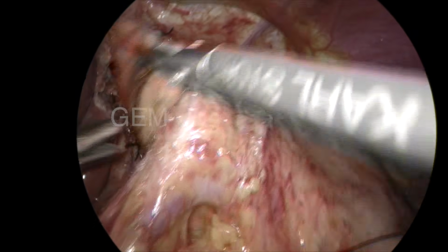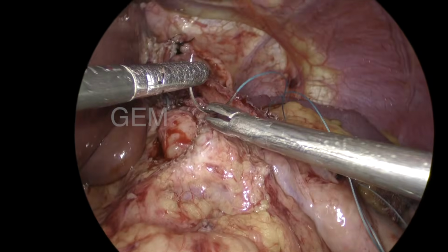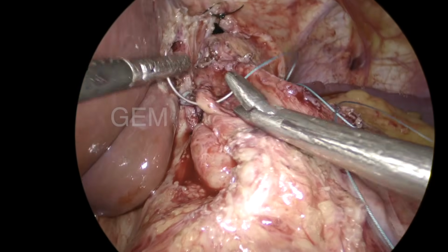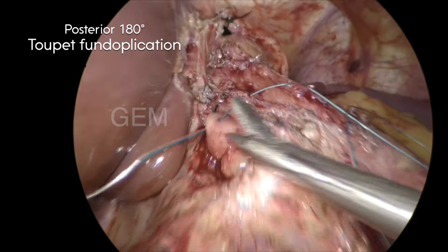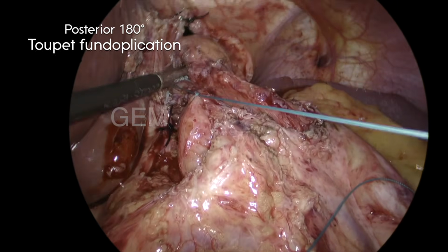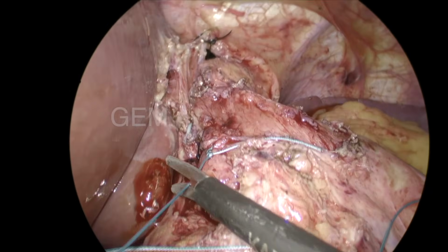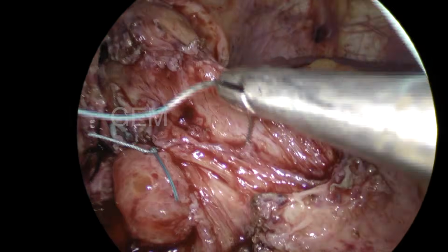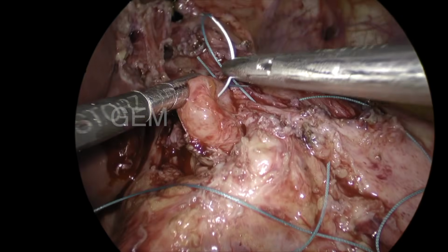Minimal correction is enough. I take the posterior fundus. It is not under tension, so it is lying freely. The fundus is lying on the right side. I'm taking a divided edge on the right side, and then I'm suturing it. Usually, I take the fundus, and you can see it's on the right side. I do the first 3 sutures with a 1 centimeter gap, so it will be a 3 centimeter fundus wrap, a posterior Toupet fundoplication wrap after myotomy.